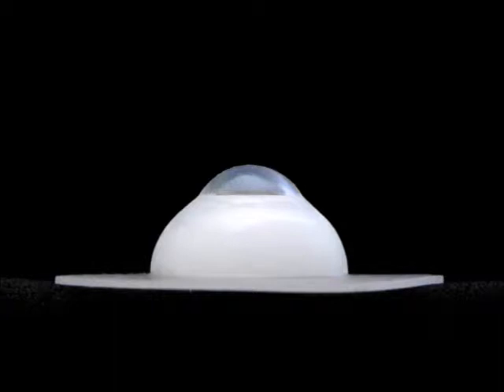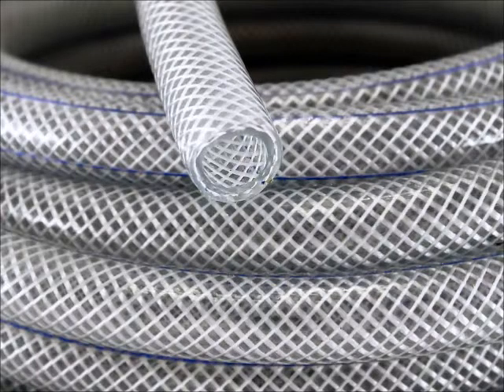Currently, we are only simulating post-occlusion surges. In an eye model, we would be able to create a more realistic simulation. Another future suggestion is testing reinforced plastic tubing. While looking for different tubing materials, reinforced tubing was an option, but there was none that was readily available in the inner diameter we needed. Most likely, the reinforced tubing could be a custom order so that it matches the proper inner diameter.